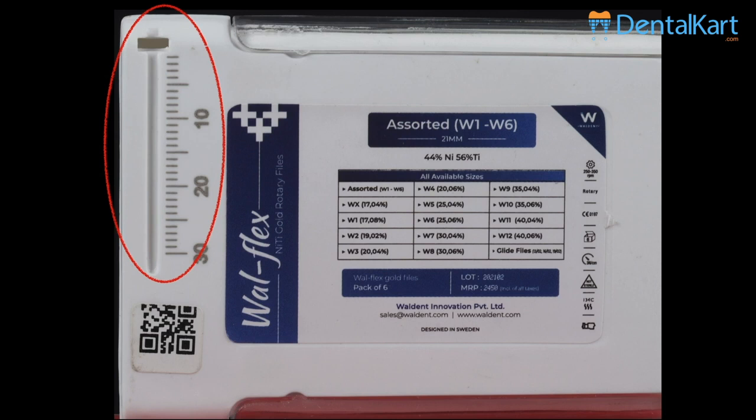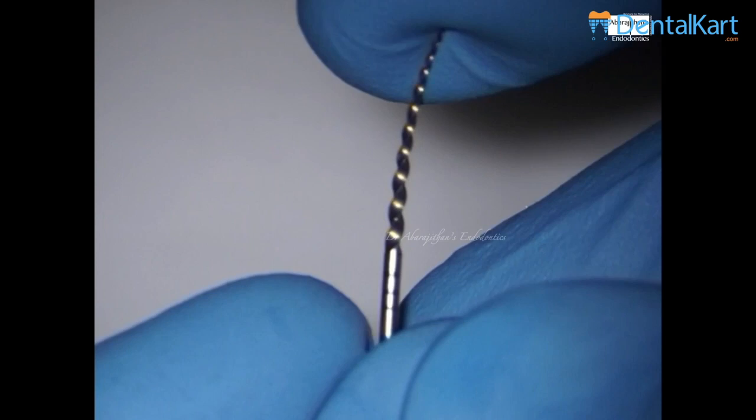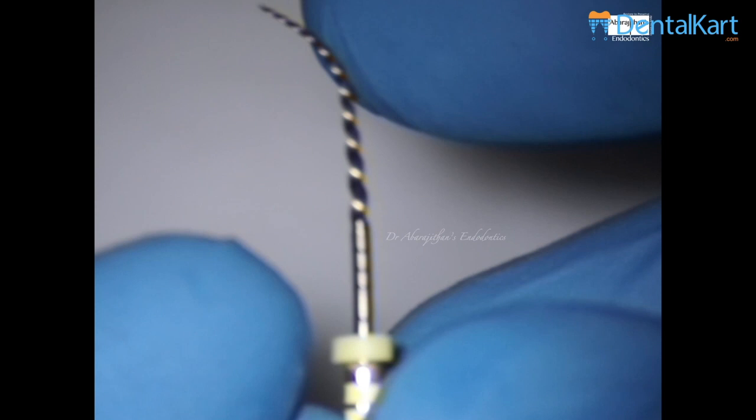I feel this will be really useful clinically. Whenever I receive a new file, this is one thing I do — the pre-bendability test — because all these heat-treated files have this property which is very useful in areas with limited mouth opening or restricted access. This file was nicely pre-bendable and did not have much shape memory.